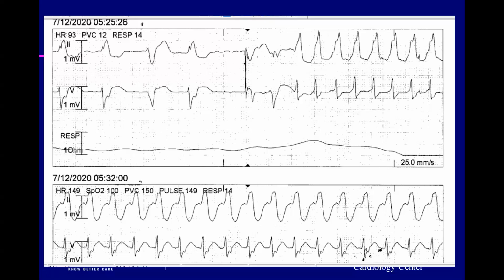Yeah, that's ventricular. It makes me think, what is the supraventricular rhythm here? Probably AFib. Yeah, AFib. And that's typically what you see. And the patient has either a defibrillator or a pacemaker, because what you see here, from here to here, enough time passes so that the time is up, and your pacemaker stimulates your ventricle. Yeah, he has an ICD, primary prevention, that he has not used for 10 years. Okay, so I know he has AFib.